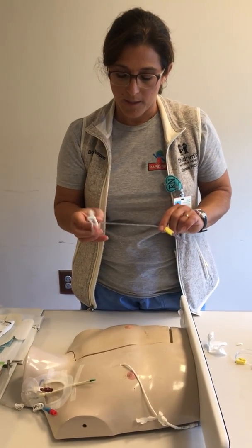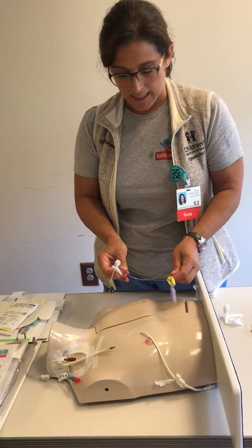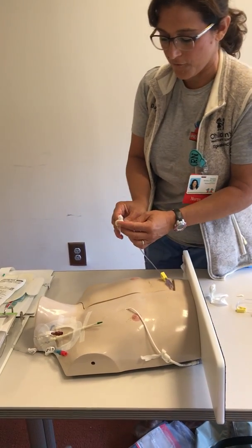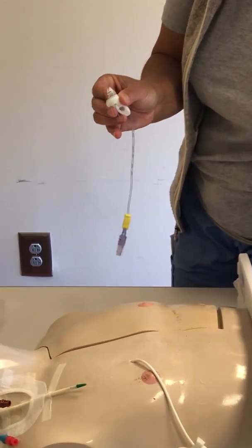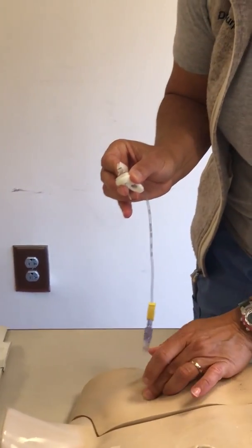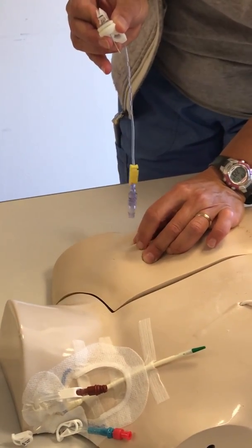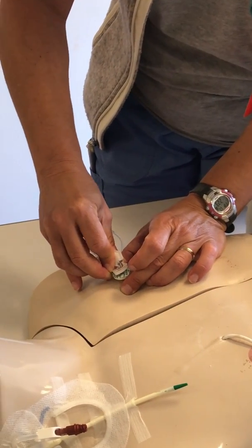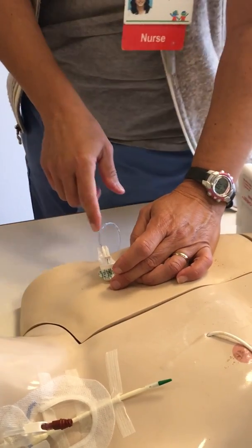So I've got my port needle. This has been primed, and again, this is all done sterilely. I like to use the biopatch, though people use a different way. I like to put the biopatch in first, hold the sides, remove the plastic, and feel for the port. There are 2 kinds of ports, and I'll get to that in a minute. Put your fingers around the port, use your pointer finger to feel the center, and go in at a 90-degree angle into the port. Make sure you're not going into the same hole that you were already in.